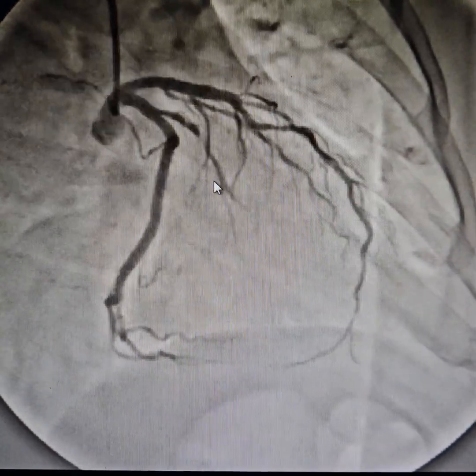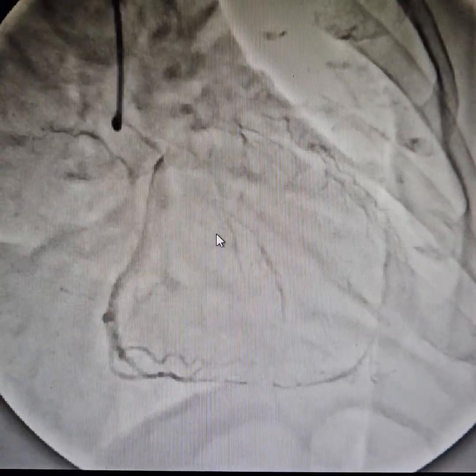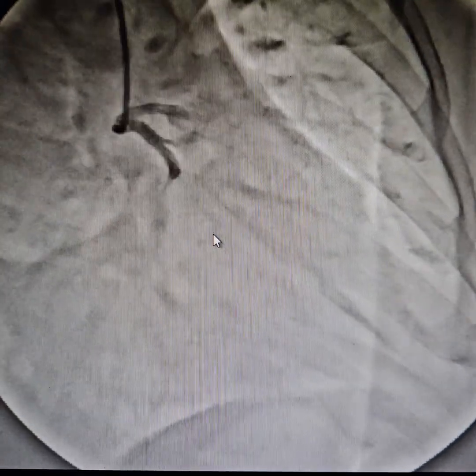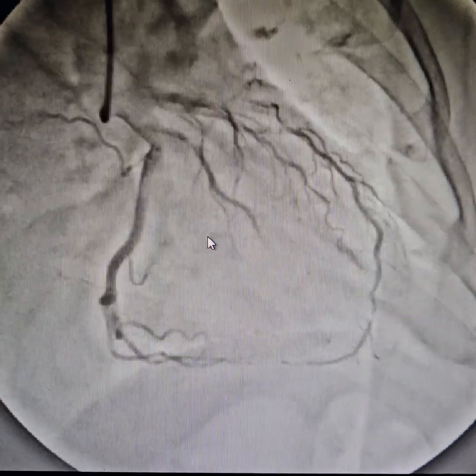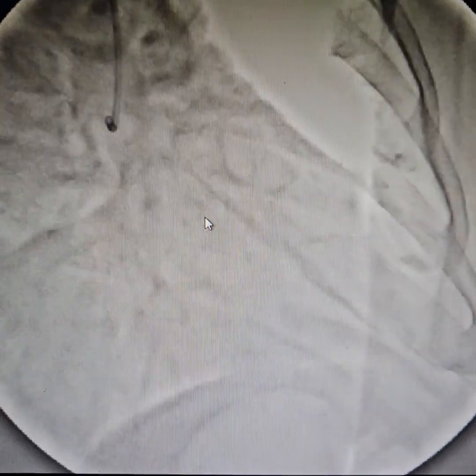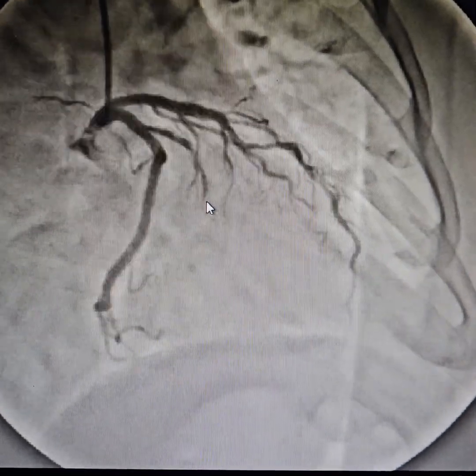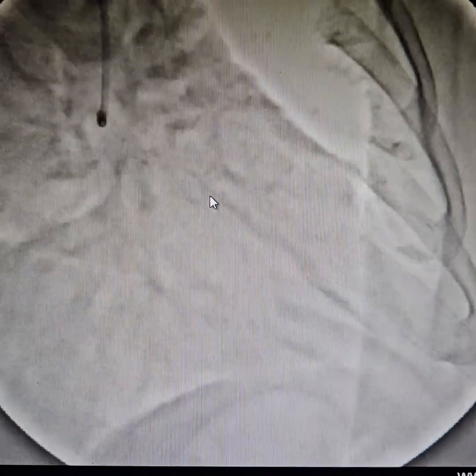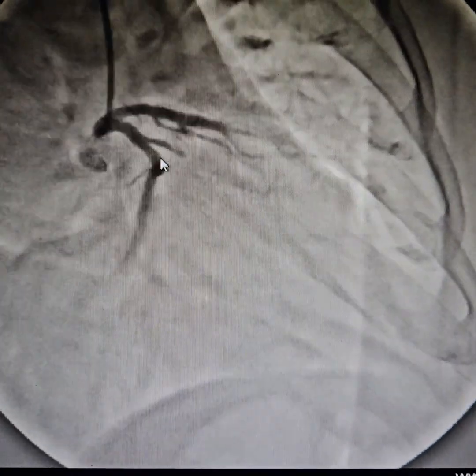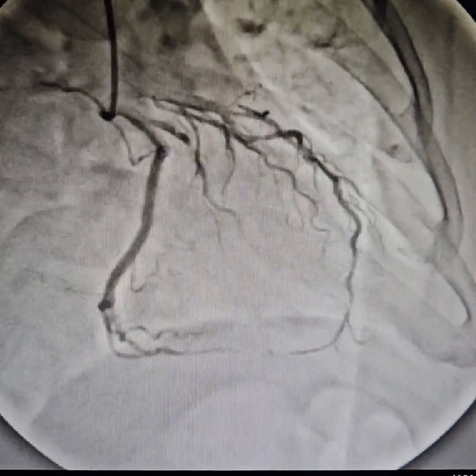There is very sluggish flow in the obtuse marginal artery, which likely seems to be a very big artery, but in the angiogram it does not appear so because of the slow flow.